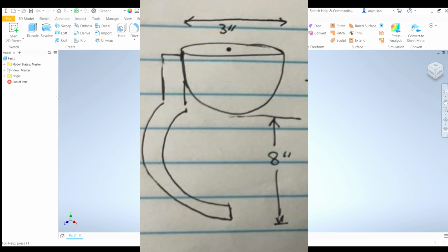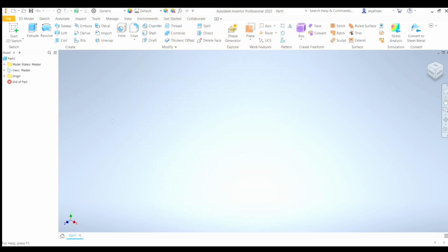prosthetic. For example, maybe I know that the person who's to wear this prosthetic has their amputation site about 3 inches in diameter, and will probably also know the height of the bottom of the amputation site to the ground. Probably that's 8 inches, or in this case it is 8 inches. So this is clearly very small. It's not for a human really, but that's just for the purpose that if you have a small 3D printer, you'll be able to 3D print this thing. And so yeah, we can get started once we have an idea of what we want to make on Inventor.